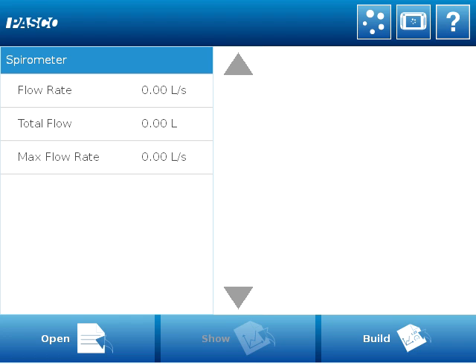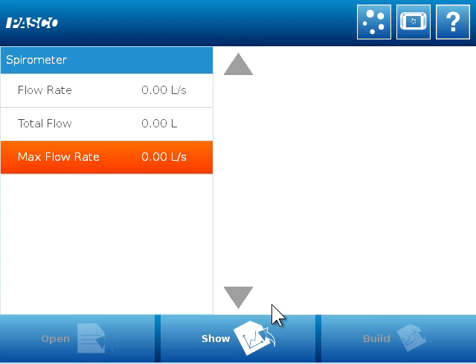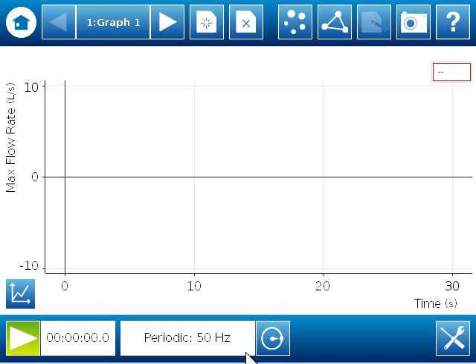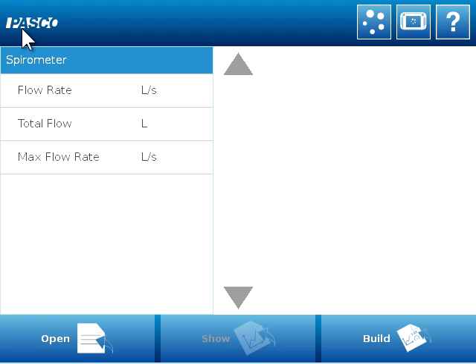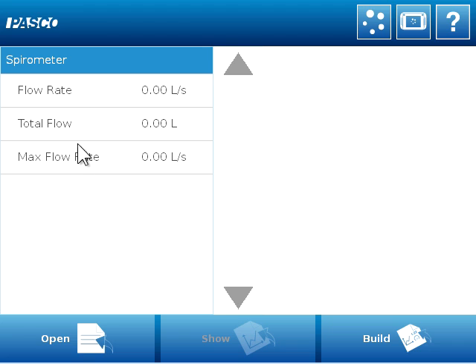I'm starting on the homepage of SparkView. You can see that I already have my spirometer connected to a SparkLink and then to the computer because you can see the measurements that the spirometer has of flow rate, total flow, and max flow rate appearing on the screen. So I could click any one of these and select show to get a display, but what I want is to be able to calculate lung volume. That's a very common measurement in a spirometer experiment, but it's not one that you can directly choose from the homepage.